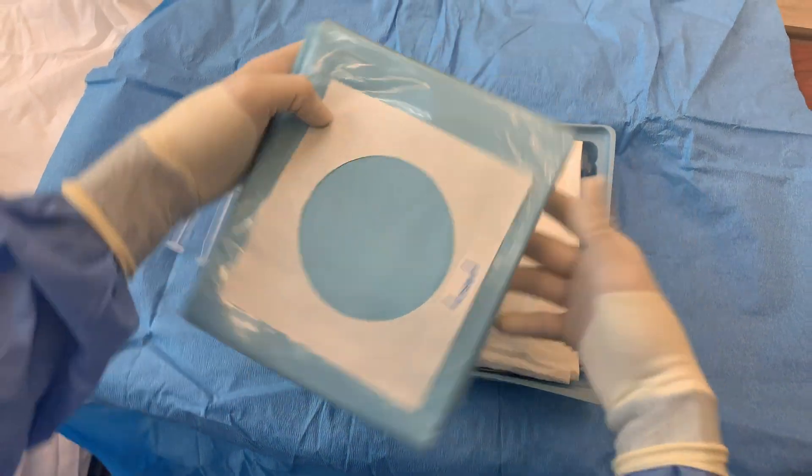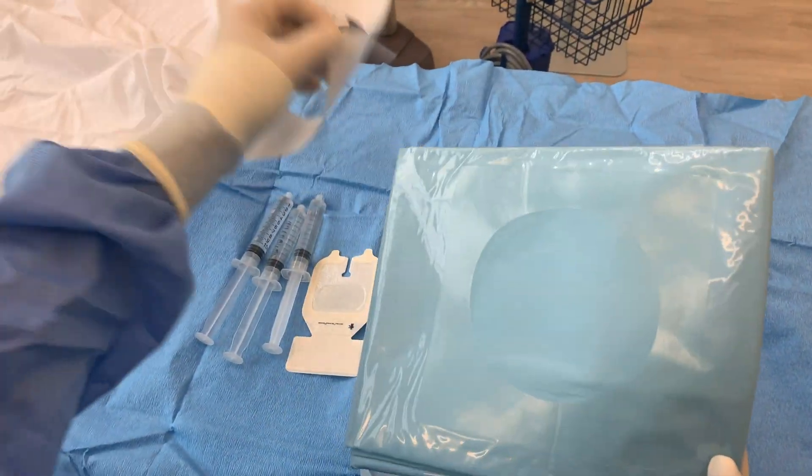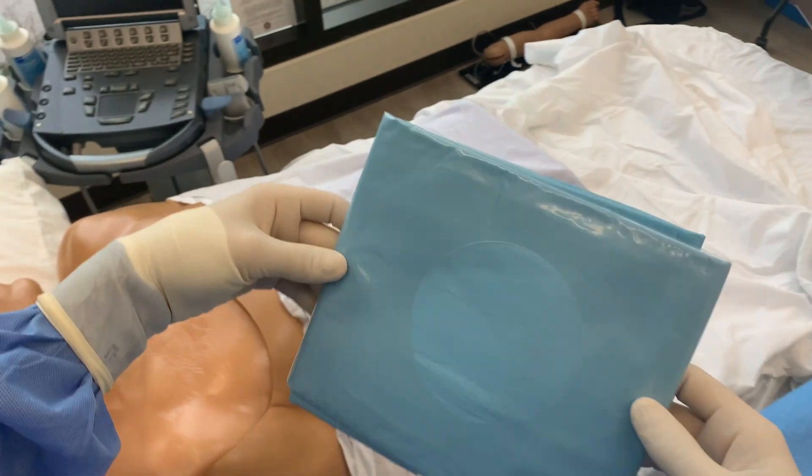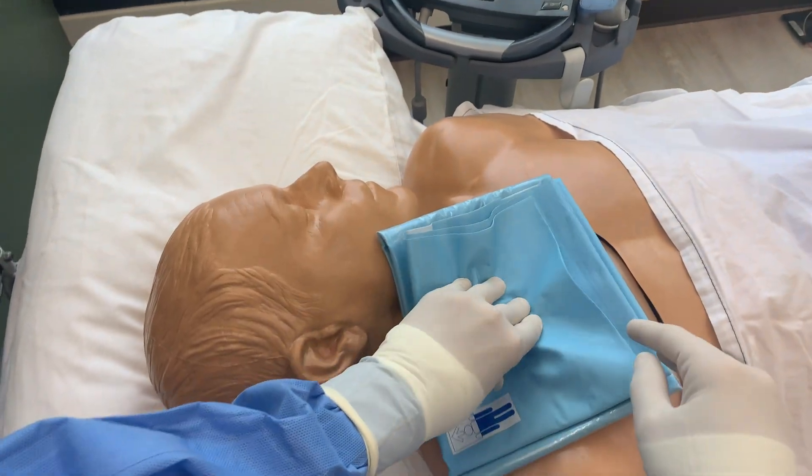Next, identify the direction of the drape and remove the backing. Center the hole over the insertion site and unfold the drape in a sterile manner.